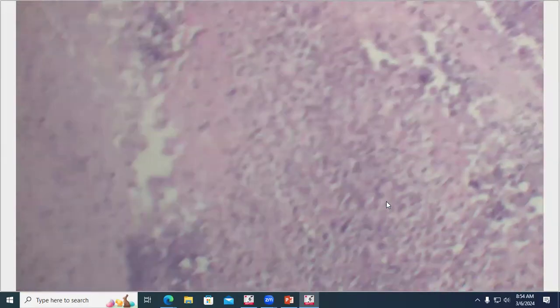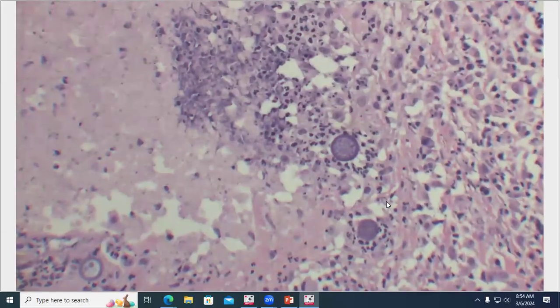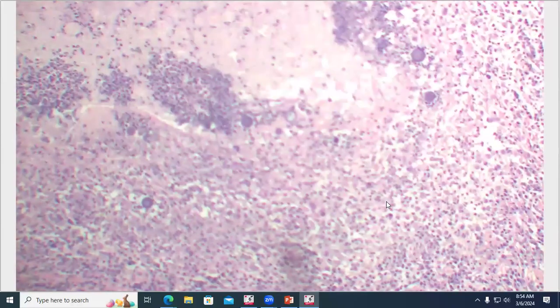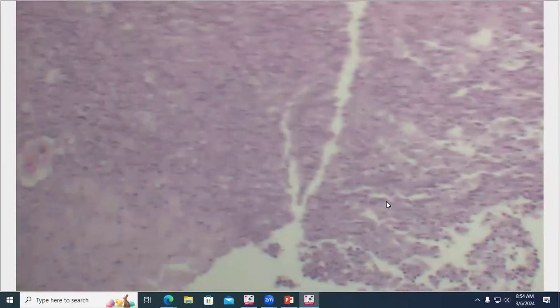Anyone else remember the term? What am I thinking of? Let me find you some of the other stages. So a lot of these are in the same sort of stage as the ones we've already seen, but there are definitely some others around. Do you think about endosporulation? Yes, yeah, there are some really good examples of. Let me just find them.